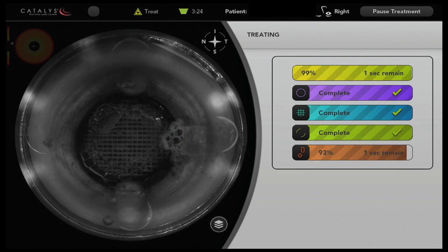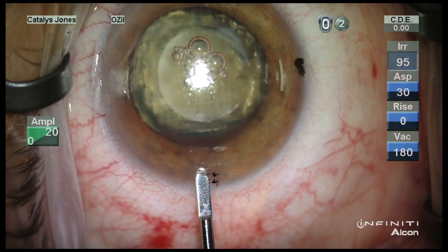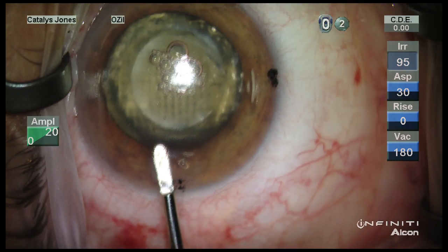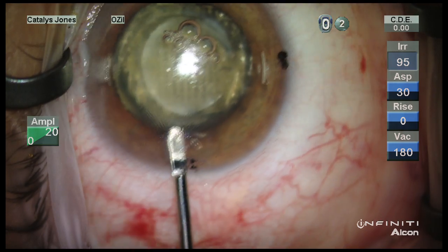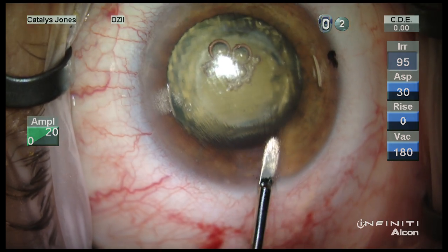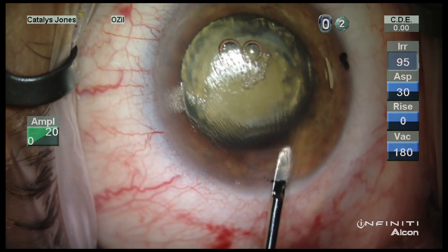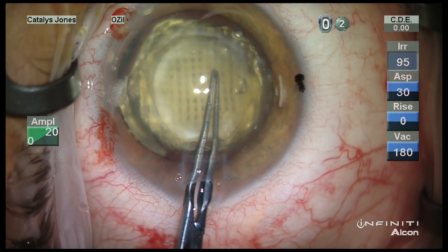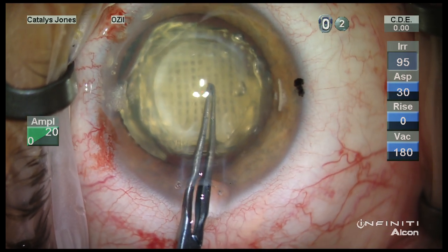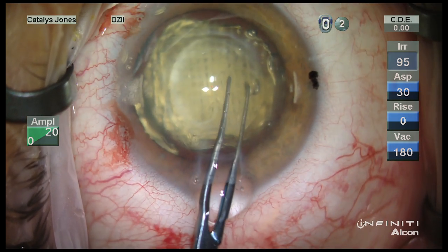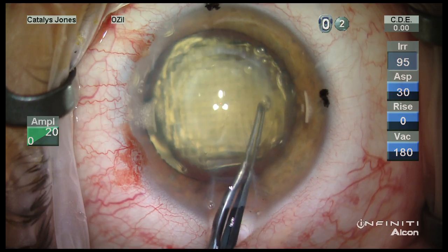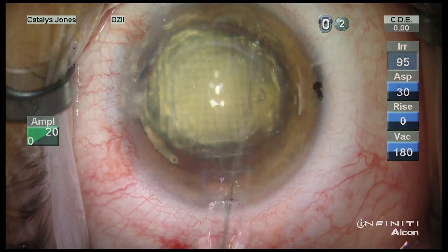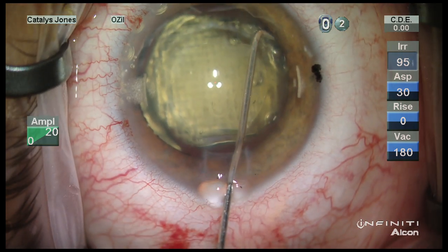You can see a bubble breakthrough on the epithelial side going into the liquid optics interface. The temporal wound is dissected open using a spatula dissector and then the capsulotomy is verified to be free from any tethering attachments and then removed.